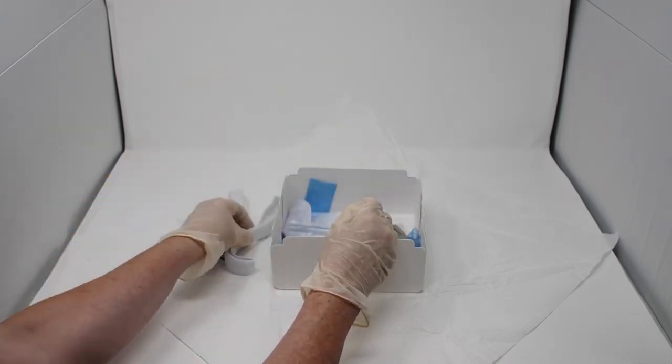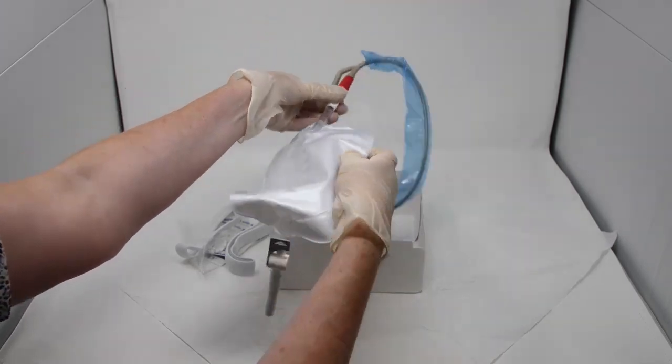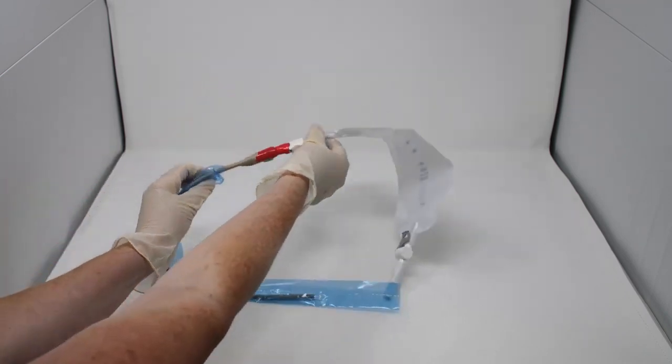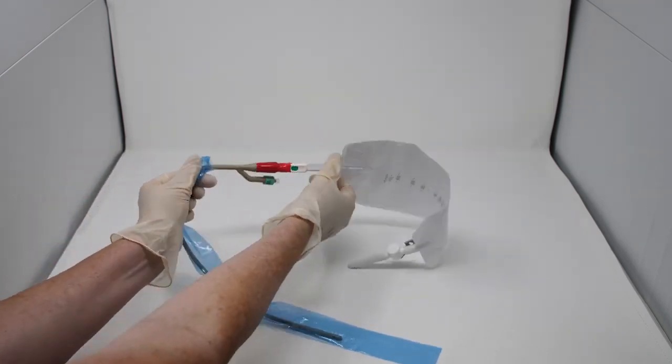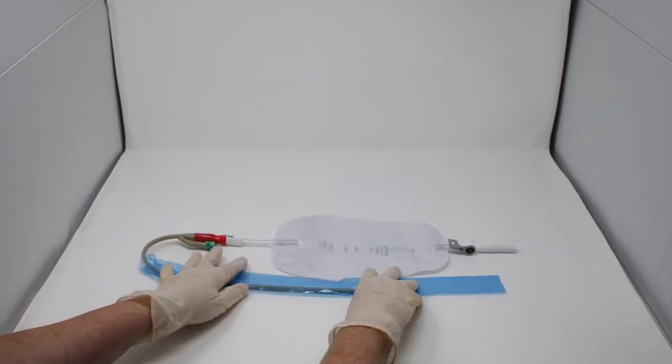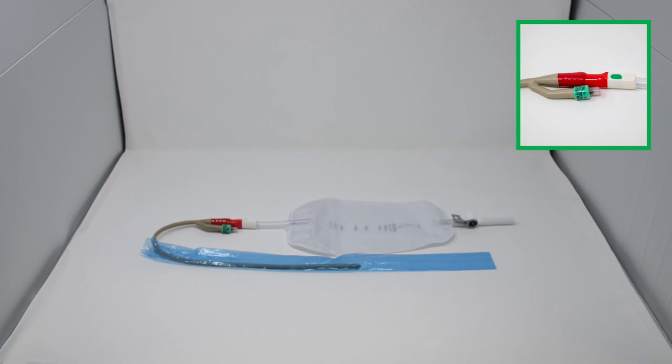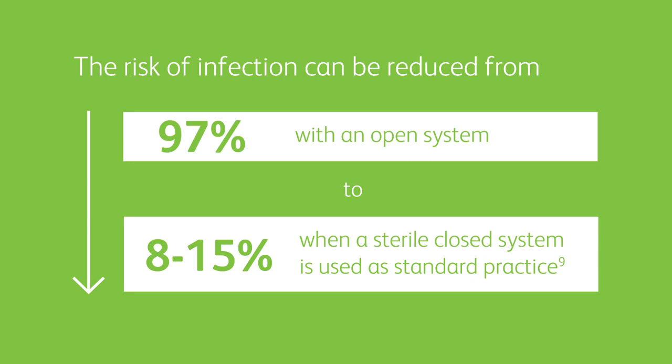In the base of the tray is the pre-connected catheter and drainage bag. The red tamper evidence seal is a main feature of the pre-connected catheter, preventing accidental bag disconnection and discouraging unnecessary breakage of the closed system. The pre-connection enables a sterile, continuously closed urinary drainage system to be maintained, which is central to the prevention of catheter-associated infection. It has been demonstrated and referenced in NICE guidelines that the risk of infection can be reduced from 97% with an open system to 8-15% when a sterile, closed system is used as standard practice.